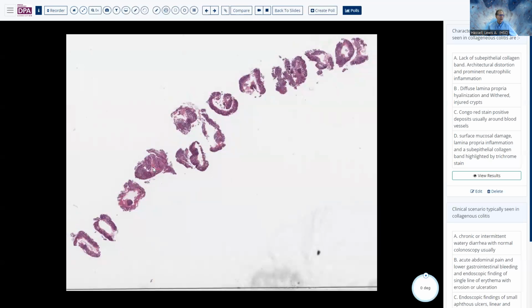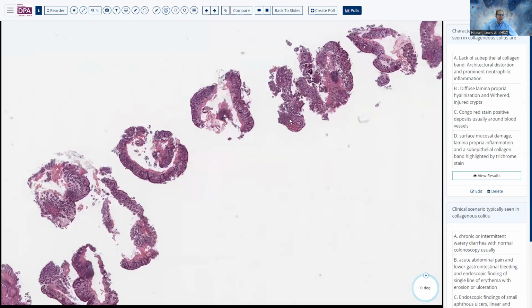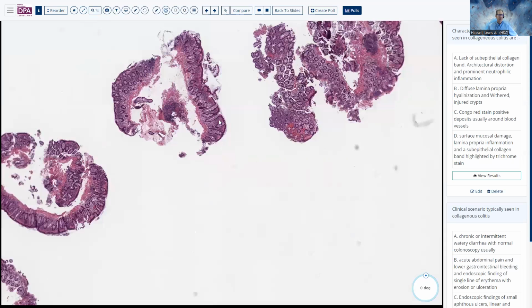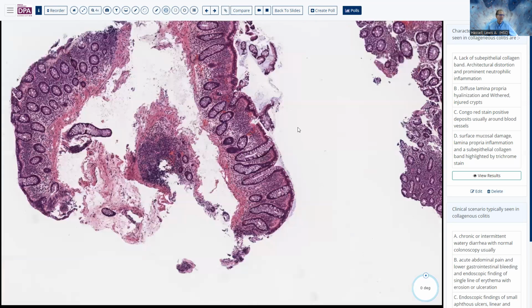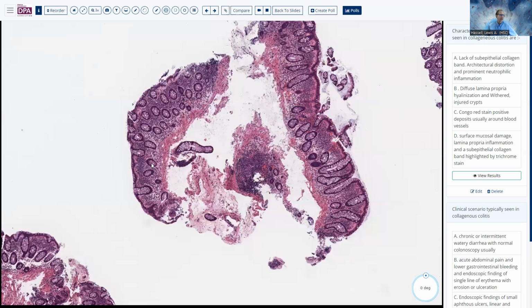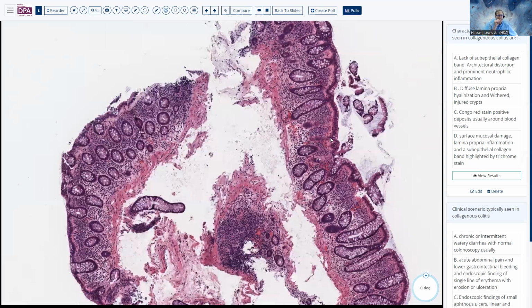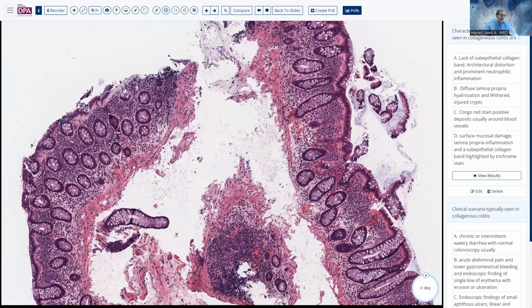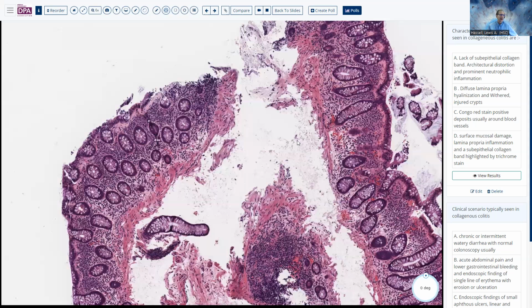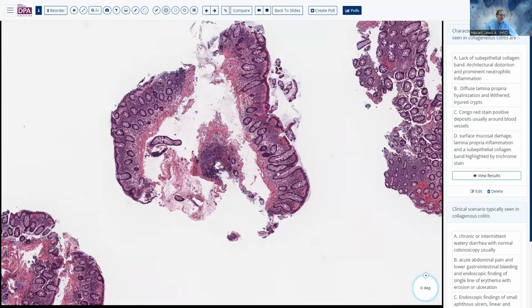Okay, still here in the tubular tract, and now we're down into the area of the colon. As you can see here, we've got sort of random biopsies, a lot of them. Typically this occurs in the setting where the patient has diarrhea and the endoscopist doesn't see anything, and so they say, hey, is there microscopic colitis? And this is a disorder that even at low magnification should jump out at you.